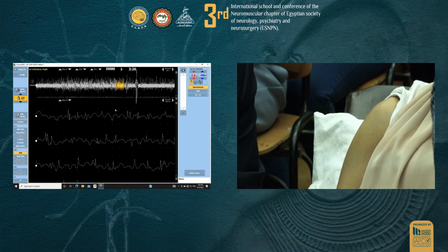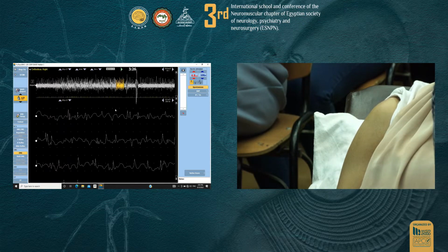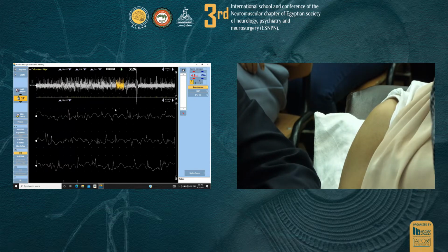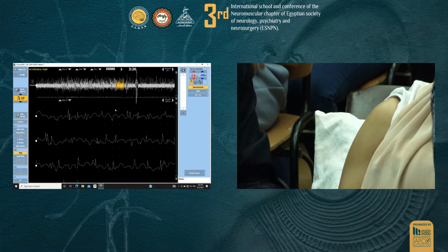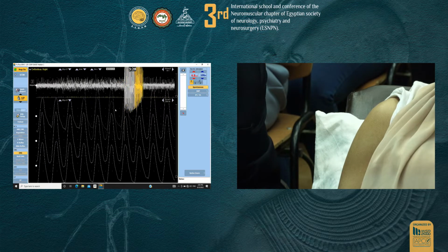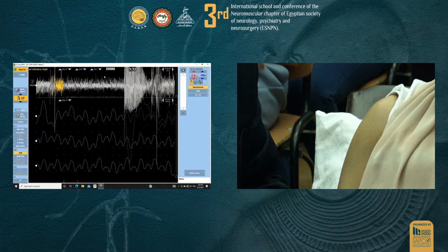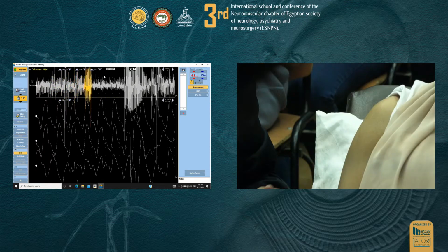So grounding, yeah. So let's try another electrode and see. But if not, we got good examples I can show you. But for this patient, I also wanted to study 60. Go to 60 notch filter. It's already on.